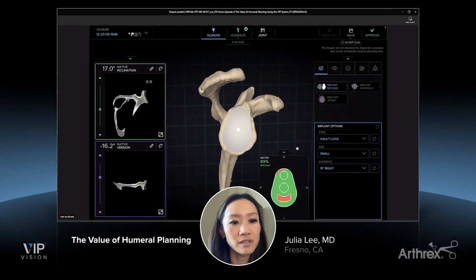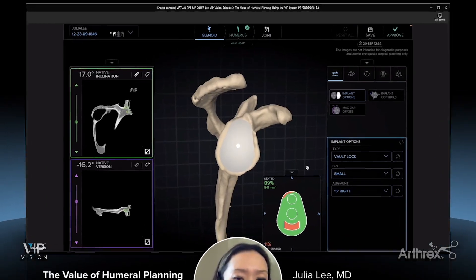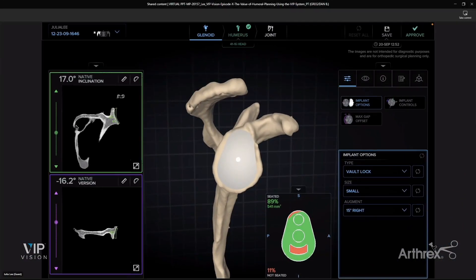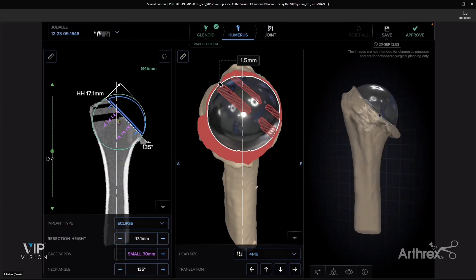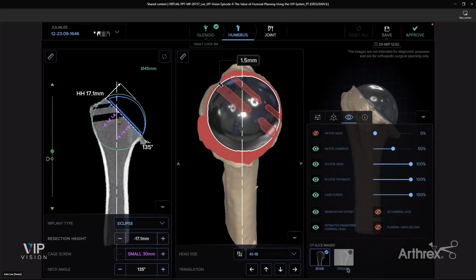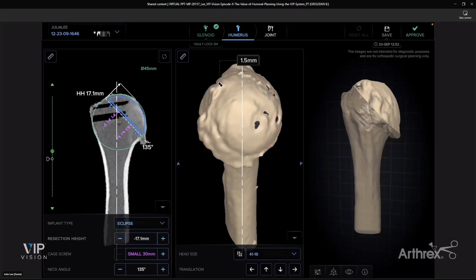This is usually the screen that shows up when you first log into your VIP account. This particular patient, we are planning an anatomic component — this is the glenoid part of it, with inclination and version on the left side. The glenoid side has already been planned, so let's move over to the humerus. I usually start with the right side first — this is a 3D rendering of their humerus. Since this is a right side, I need to switch it over to the correct anatomy. After switching it, I put the humeral head completely back on because I want to see what I should be seeing at the time of surgery.